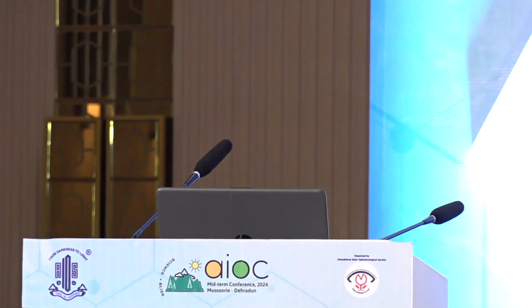Thank you. Excellent presentation, Aditi, and definitely very heroic saving the situations. I think the use of OCT in all these complex situations is a very useful tool, also in the case where you have epithelial ingrowth, because you see a very high reflectivity in the OCT, and that helps you identify, because like you said, the sheet is way beyond where you think you can clinically see. So there are sheets of cells, but the reflectivity is so different for the epithelium, you can pick up on OCT. So you know how far back you have to retract the flap and remove debris.